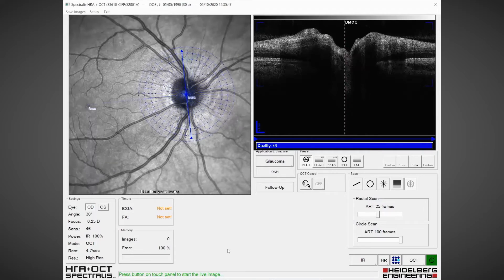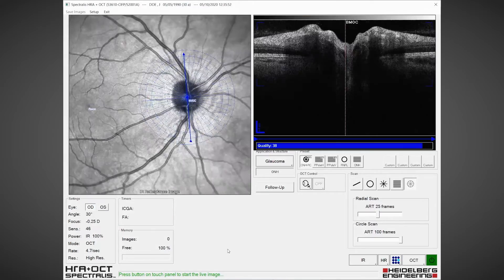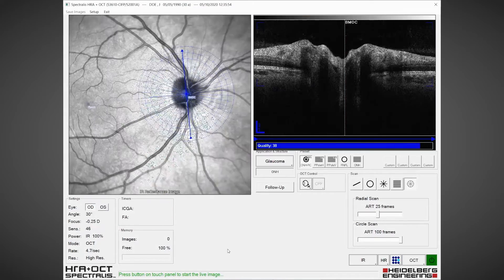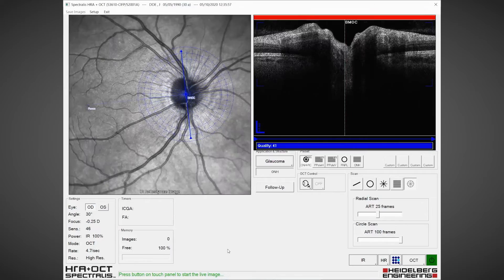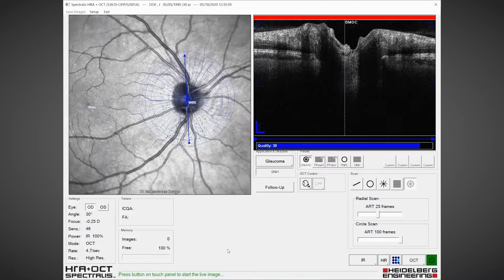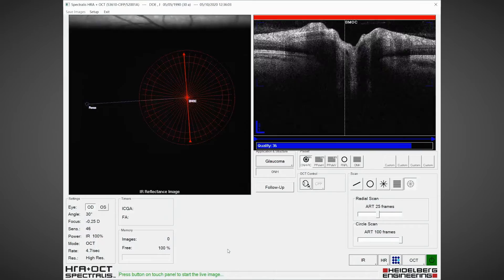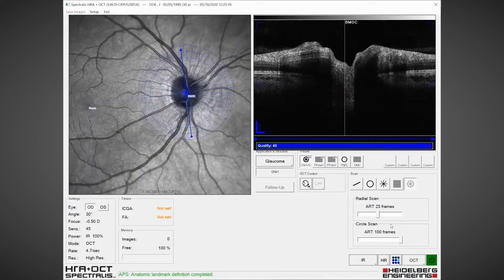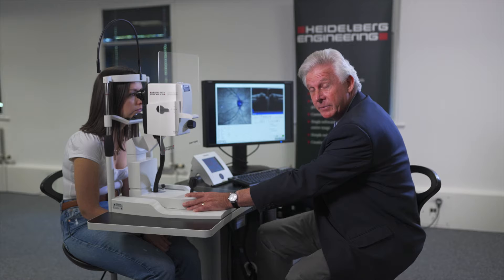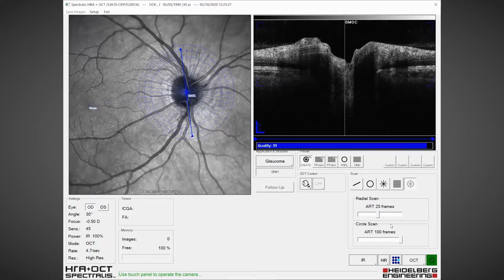If I ask my patient to slightly move their head, you can see that position remains fixed — this confirms that we have TrueTrack live eye tracking working, which gives very high reproducibility on follow-up. We fix the axis of the fovea to the optic nerve centre for each individual eye, and now we can start scanning.